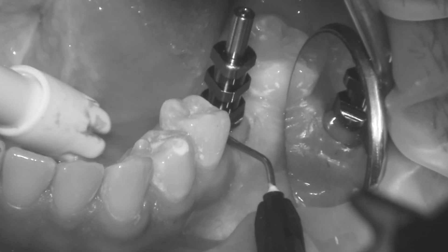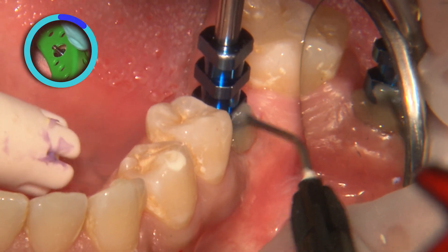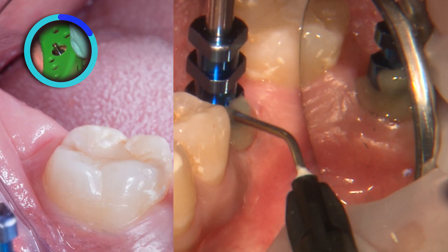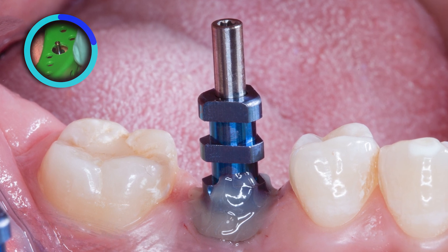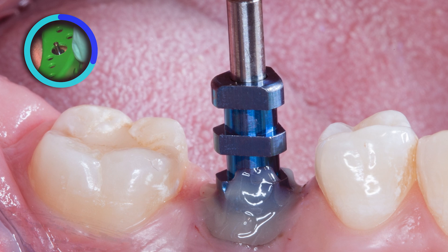In this example, the emergence profile of the impression coping was again customized by adding flowable composite. As a reminder, this will prevent soft tissue collapse, allowing the transfer of the soft tissue profile that was created either with a custom healing abutment or provisional restoration.